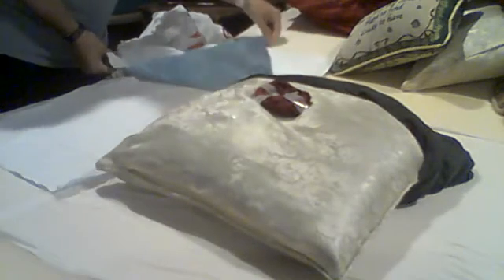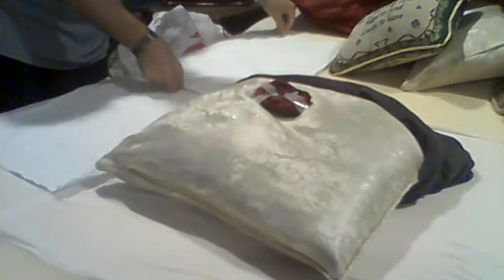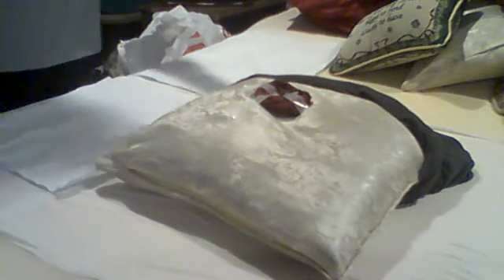So the next thing that I need to do is take my gloves off, throw them away in the biohazard bin. I'm going to wash my hands again. Wash, wash, wash. After I wash them, I'm going to go ahead and get my sterile packages, open them, and get ready to dress this wound. So the first thing that I'm going to do is lay down my sterile mat. Make sure I don't touch, stay within the 1-inch border. Alright. Dispose of that.